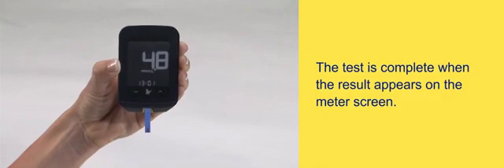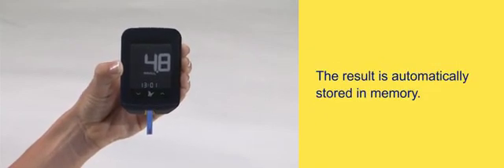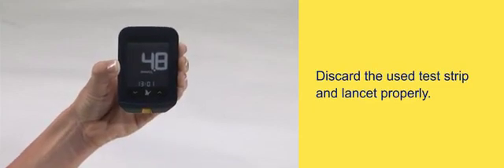The test is complete when the result appears on the meter screen. The result is automatically stored in memory. Discard the used test strip and lancet properly.